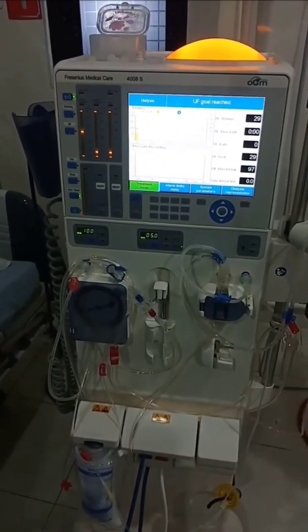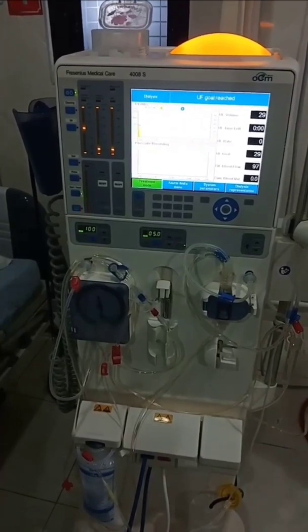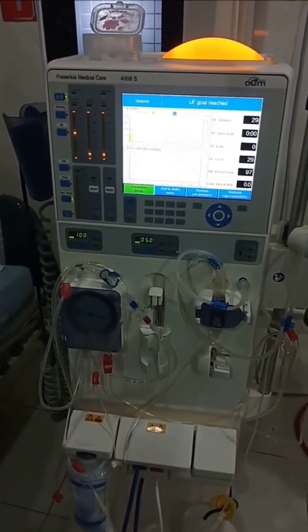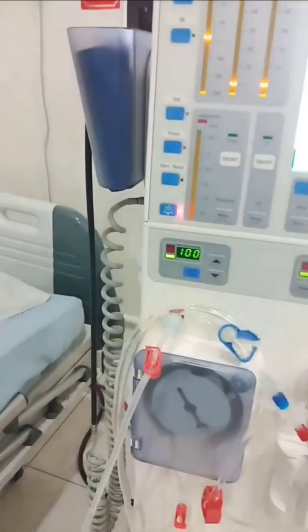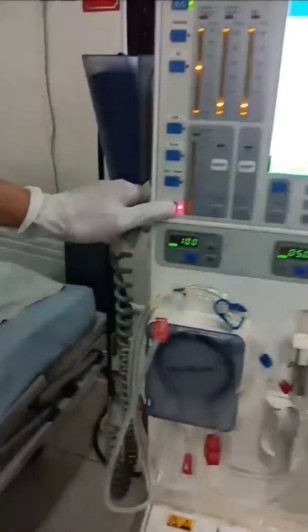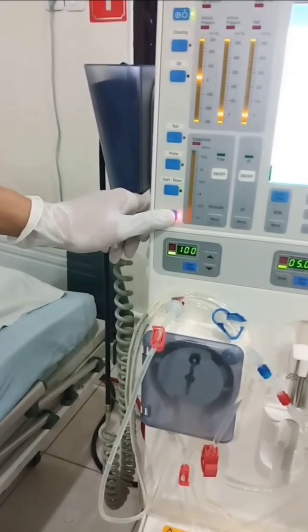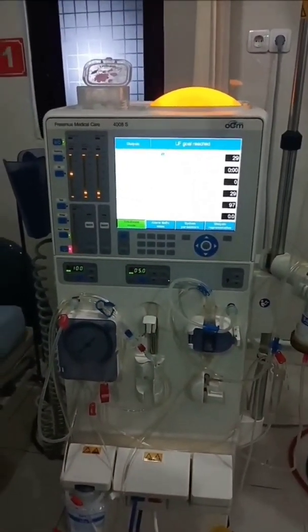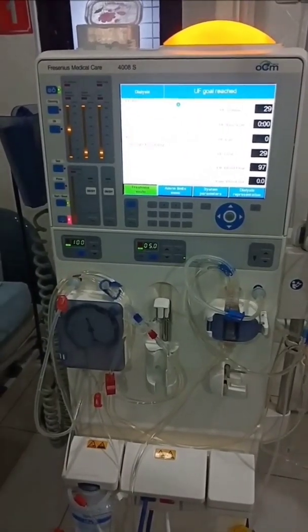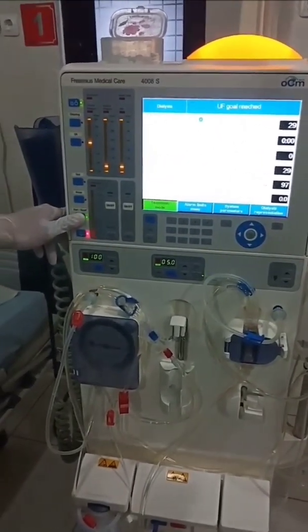After the dialysis process is complete, the screen says UF goal reached. An alarm sounds, then press the alarm mode or dialysis start button. The screen says reinfusion confirmed. Qb automatically stops.